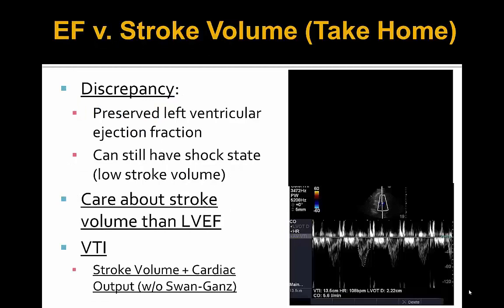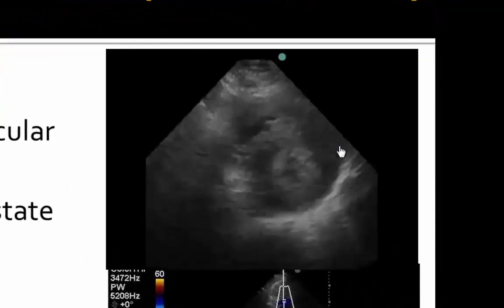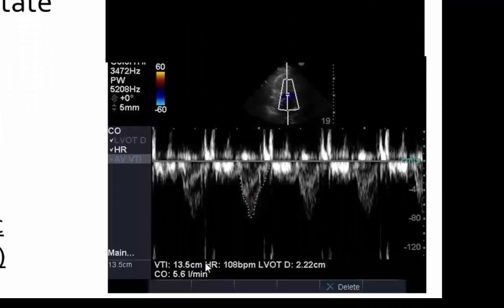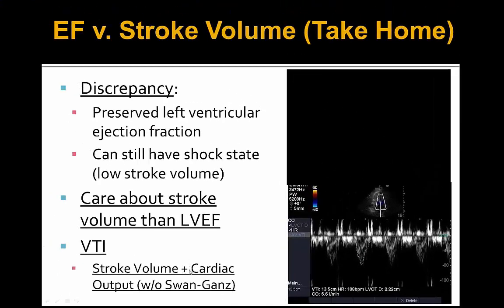The key take-home message is that there can be discrepancy between left ventricular ejection fraction and stroke volume — you can still have a shock state with a low stroke volume despite reassuring 2D echo findings. This patient had a hyperdynamic LVEF, but looking under the hood at the true stroke volume via VTI, it was only 13.5 cm — below what we expect for a normal stroke volume. In resuscitation, whether in the ED or the ICU, we care more about stroke volume than LVEF. Don't be falsely reassured by a preserved EF; look at the VTI. VTI allows us to calculate stroke volume and cardiac output non-invasively without a Swan-Ganz catheter.